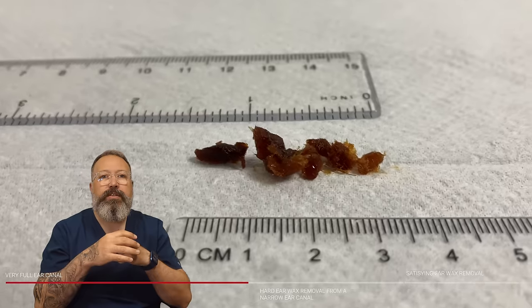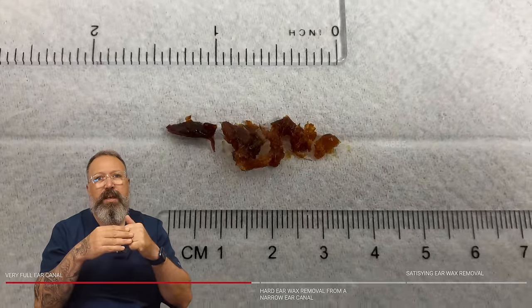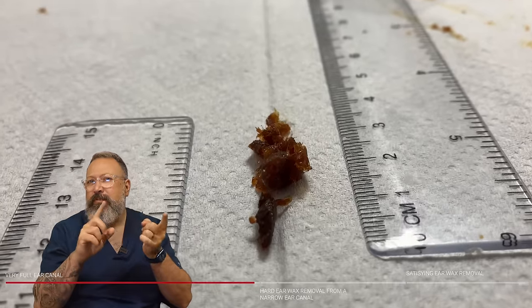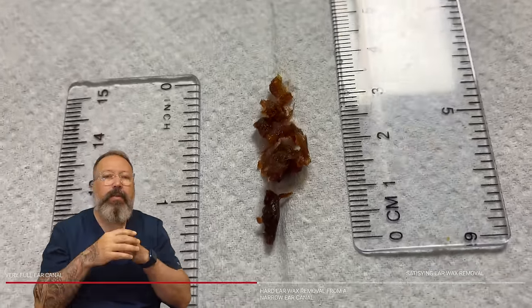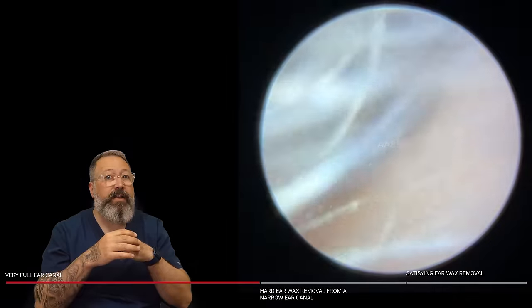I'll pop the link tree into the description because I keep forgetting to do that. So you can see — out of one ear canal we had three and a half centimetres, just under an inch and a half. Lots and lots of very thick, dense wax in that one. Patient very relieved to get that out.